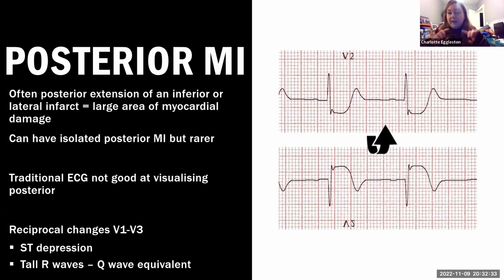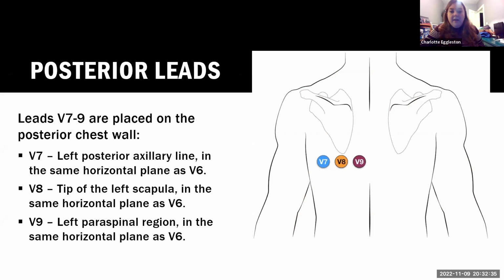So that's trying to show that kind of mirroring effect. Where we tend to put the leads is we'll do a V7, 8 and 9. So we tend to put them kind of below the left scapula in that sort of position.